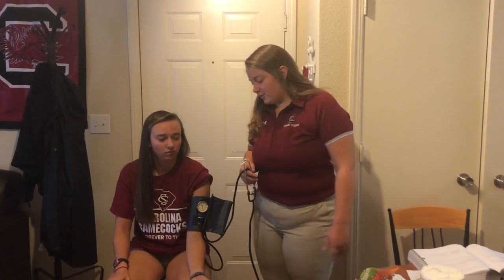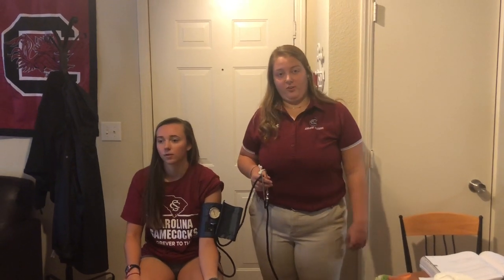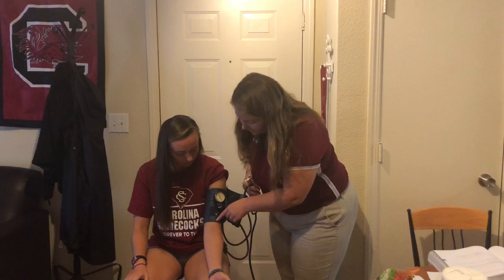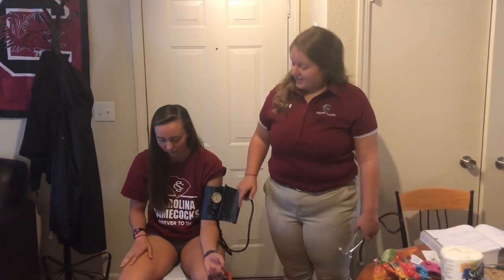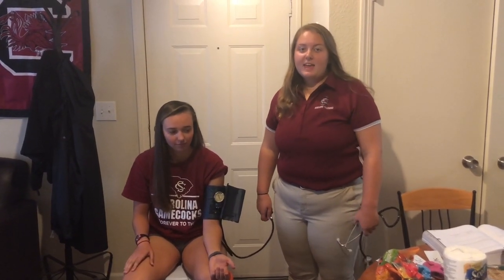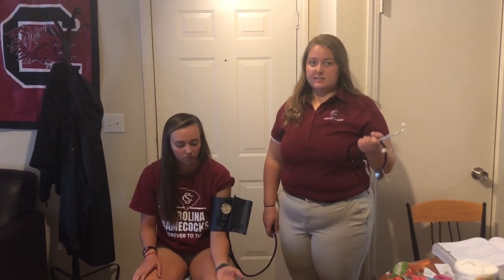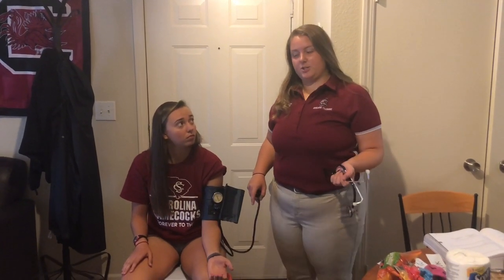To do blood pressure, you're going to attach the blood pressure cuff to your patient on their left arm, preferably. Ensure that the line for the artery is directly over their brachial artery. You're going to pump it up to 200 millimeters of mercury, then release it until you hear their pulse, and continue to listen until it goes away — that will be your systolic over diastolic blood pressure.